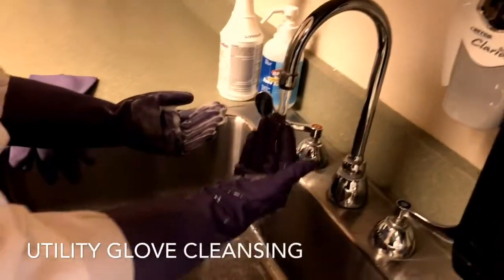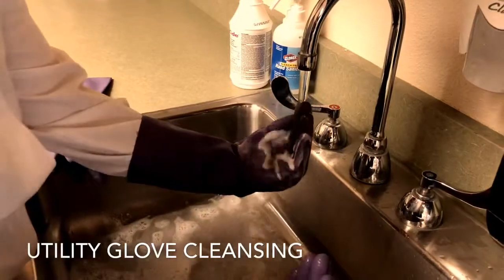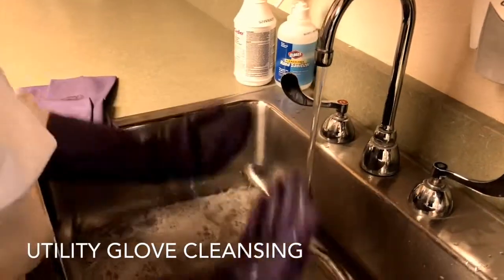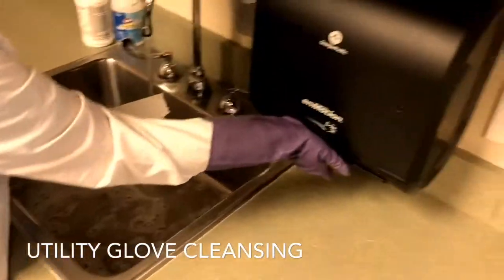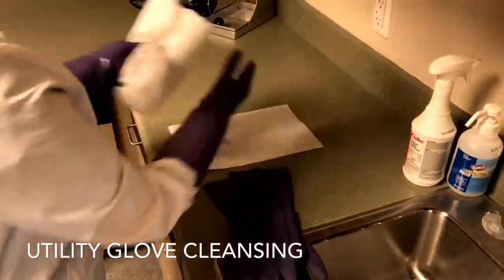Here we have Ali giving us a great representation on how to clean our utility gloves. As you can see, she's treating it as if she was washing her hands. You're going to go ahead and wash them thoroughly with the soap, rinse them out, and again, not touch anything with the utility gloves because you want them to dry off, so you could go ahead, bag them up, and put them in the autoclave.